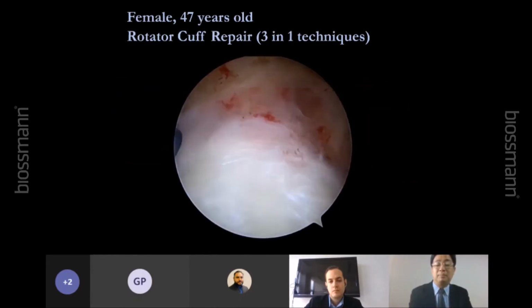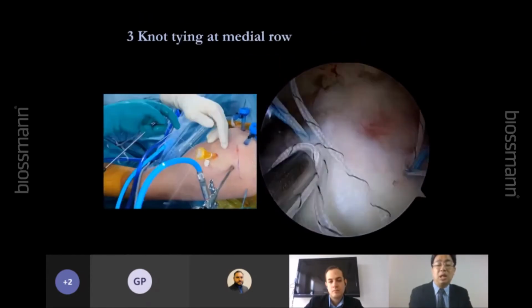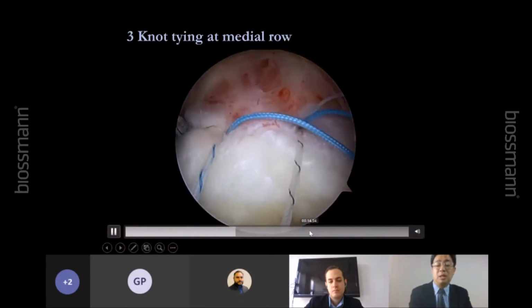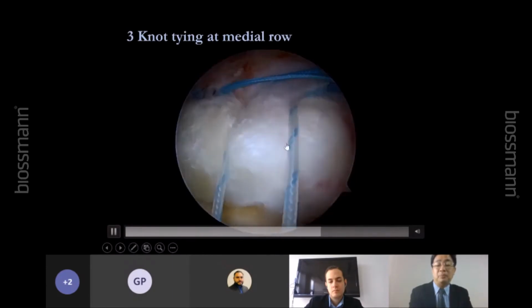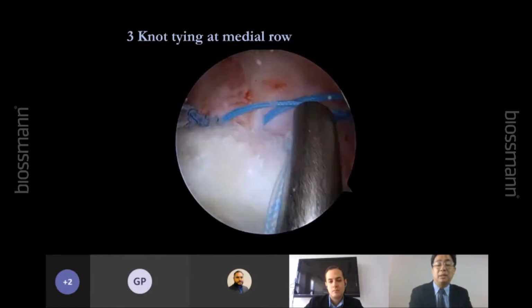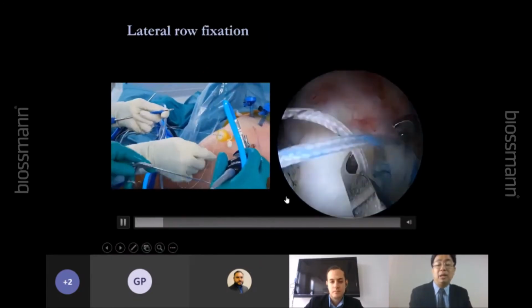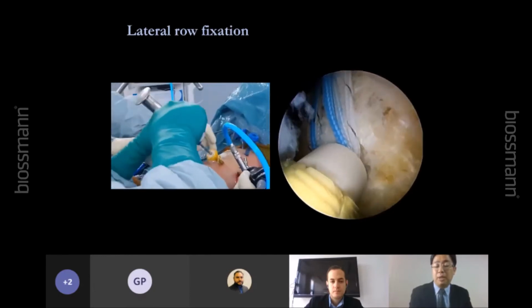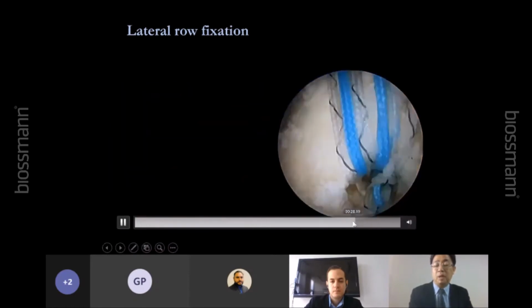So this is the way we do. I prefer to use the Spectrum, okay. So that way. So this is the 3-in-1. Okay, make a knot tying, limited knot tying. Okay, and then make a suture bridge. Okay, like that way. So in the middle, I tie the knot, one in the front, one in the back, one in the middle. Okay, like that. Okay, and then we make a knot tying. Same. I prefer to put the anchors very close to the bicipital groove because of the good bone quality. Another one close to the infraspinatus. Okay. Like that.